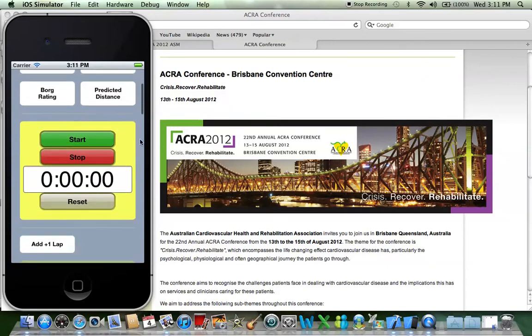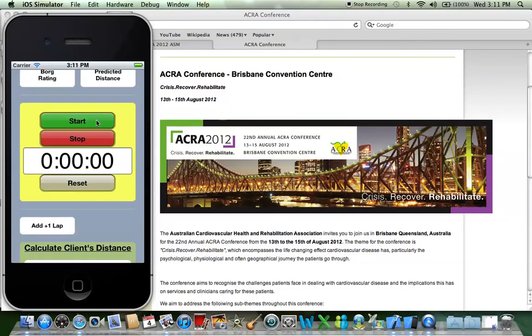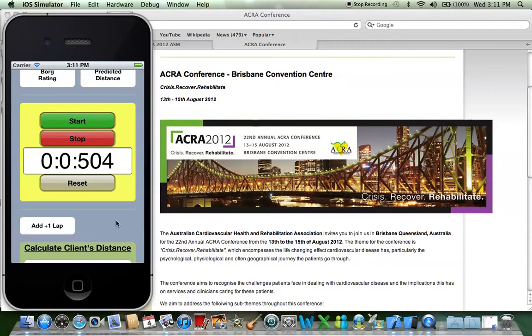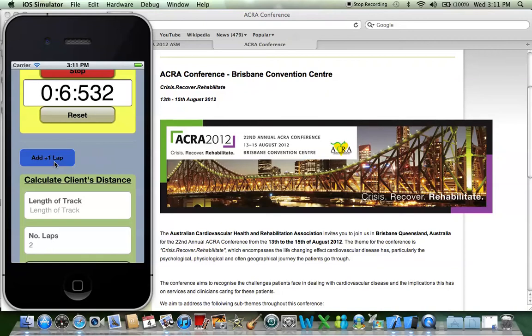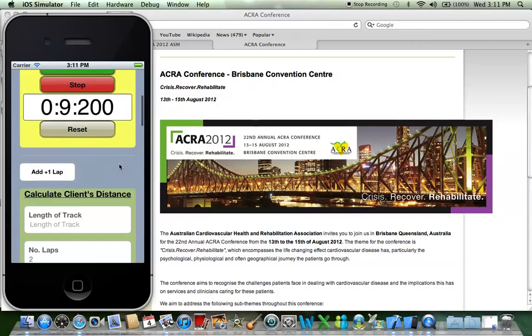Once you've given the client instructions about the six-minute walk test, you can start the stopwatch. You can also add laps like so. Notice how if you touch and hold on the screen, you think the stopwatch has stopped, but if you let go, it's actually still counting upwards.